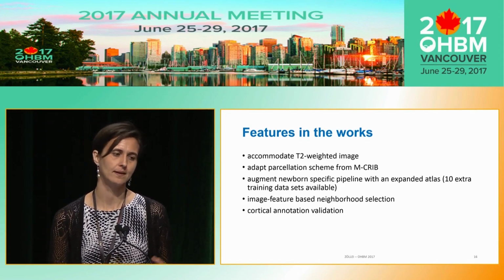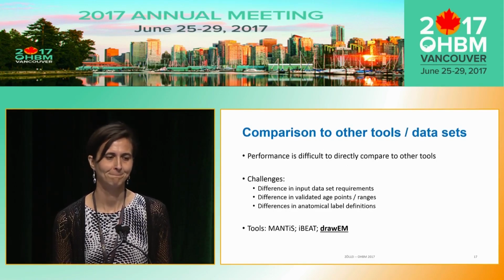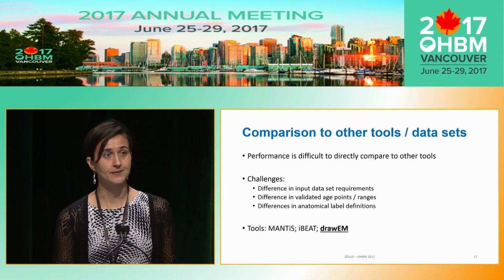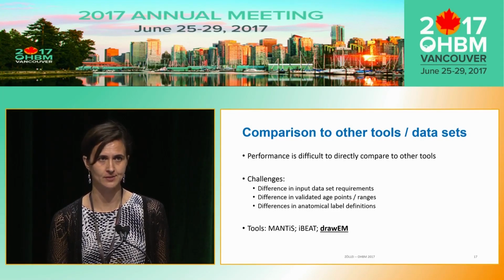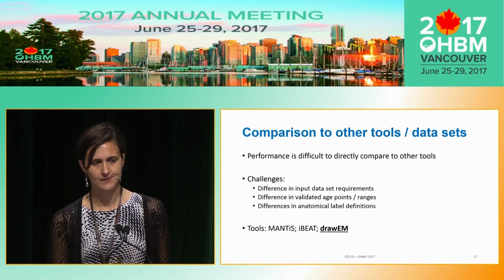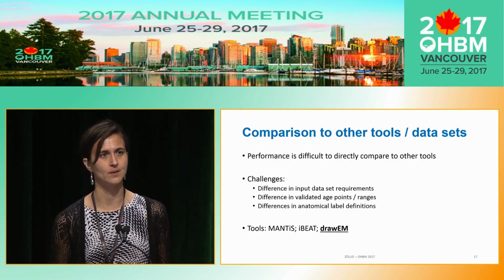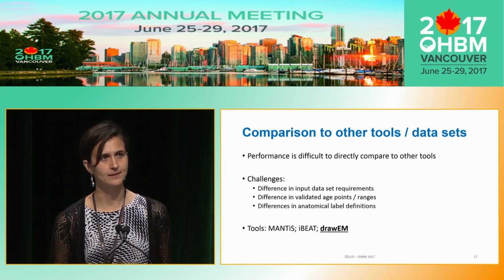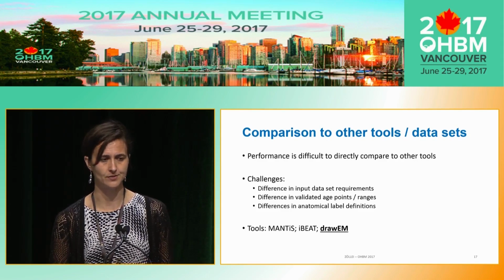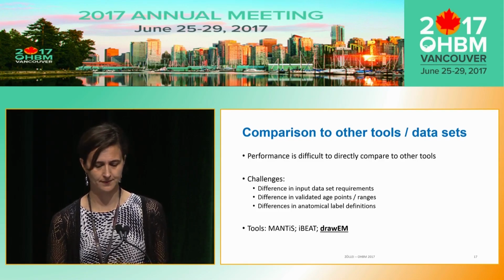And also, we would like to keep validating the cortical annotation measurements further. We would also like to do a direct comparison with different tools and atlases that are available. However, it's a very challenging task. The challenges arise given that the input data set requirements are very different among the currently existing tools. The tools have been validated or introduced for very different age ranges. And also, oftentimes, the anatomical definitions of the labels that are produced by these tools are different.